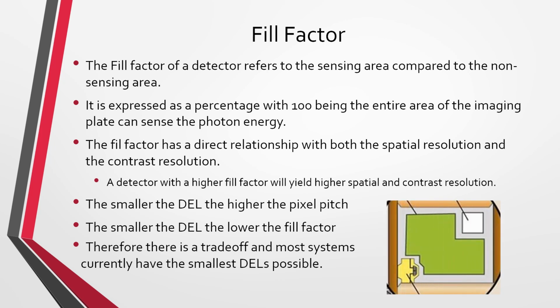If you make the dels smaller, the pixel pitch will be higher, but the fill factor will be lower. A lower fill factor will yield a lower spatial resolution and contrast resolution.